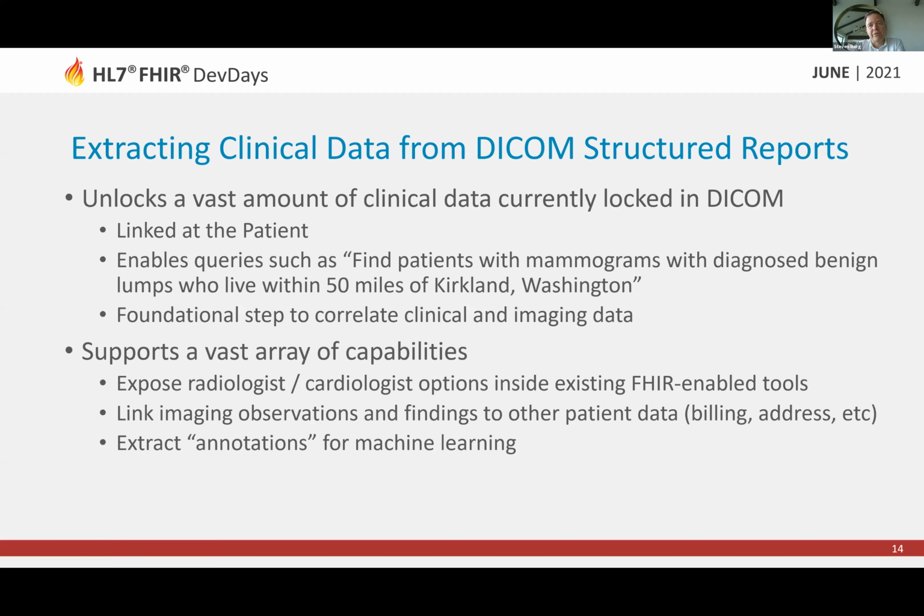This could be the next frontier in medical imaging. This AI and ML could be unlocked if we can break out of taking these annotations outside of where they're locked inside of studies, inside of DICOM, pull them out and use those poorly labeled images, which might have, as you saw in that very first example, that pointer that says, here's the best example of that mass, and it pointed to that mass. It's a poorly labeled thing.